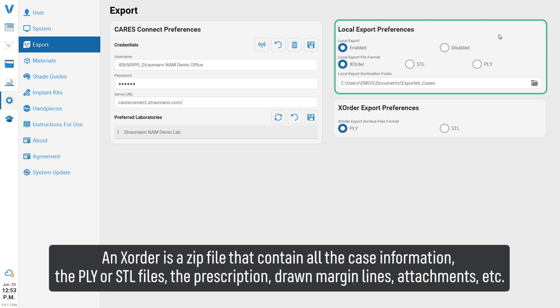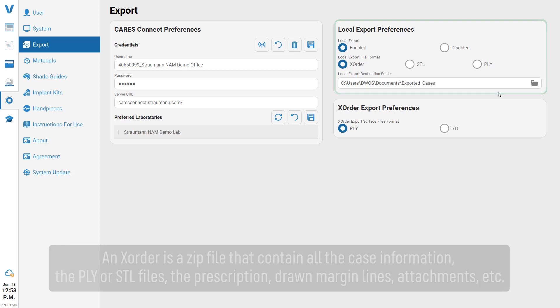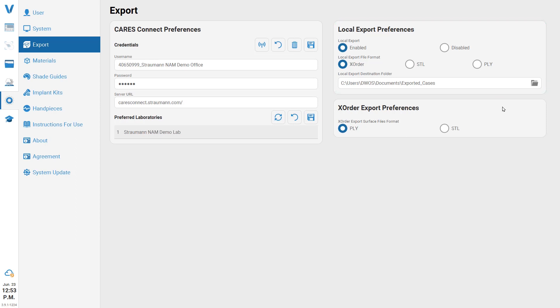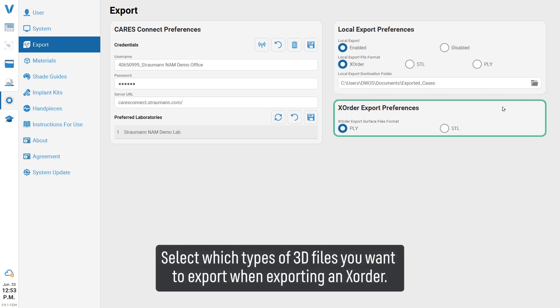The X order also includes drawn margin lines, attachments, etc. Select which types of 3D files you want to export when exporting in X order.